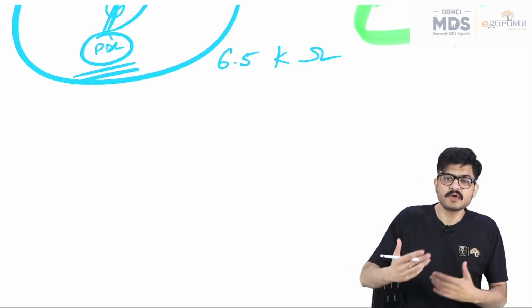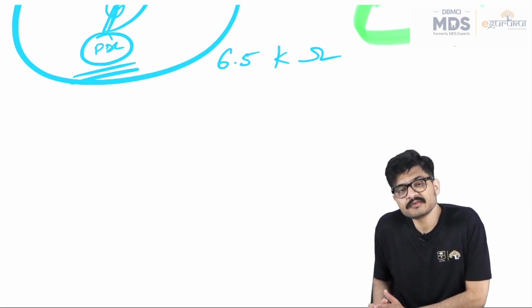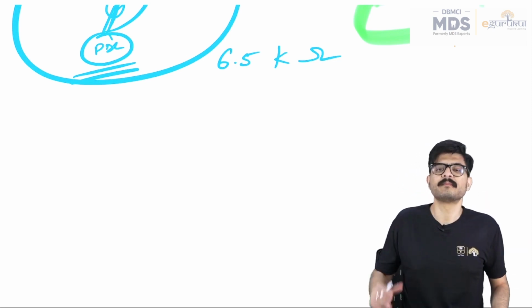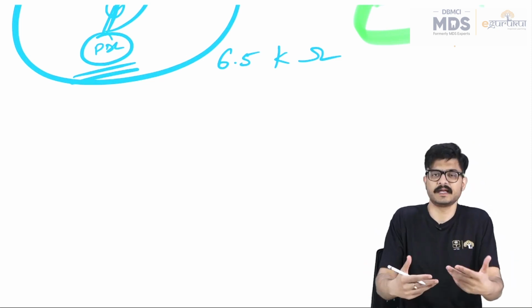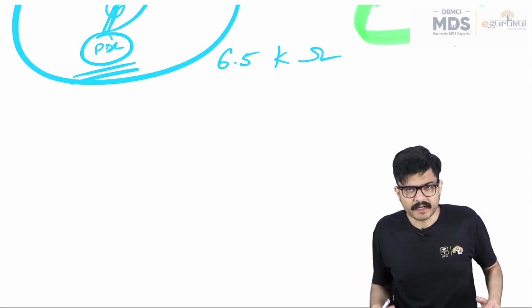or they would also incorporate other algorithms, like getting multiple values of impedances at a particular frequency and then calculating the root mean square value of those multiple values and reaching one particular value and claiming that our apex locator is better than the others. So all these permutations and combinations have been employed, right?